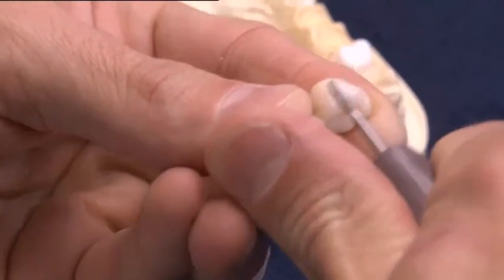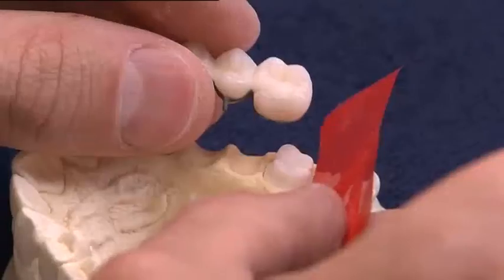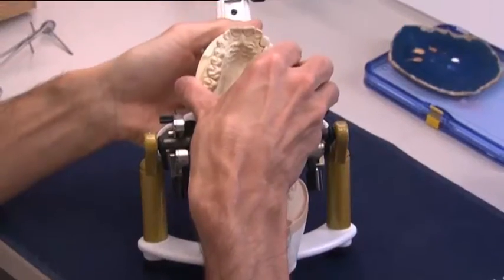After the second firing, the surface structure is designed and growth lines are applied so that the light is refracted and reflected in different ways. The contact points and function are checked again.